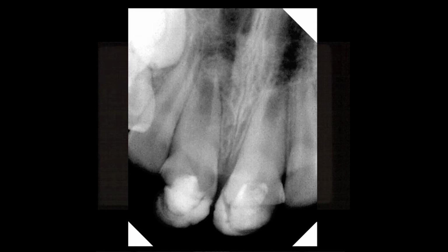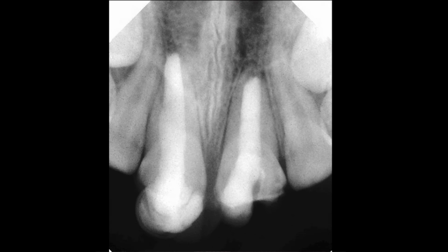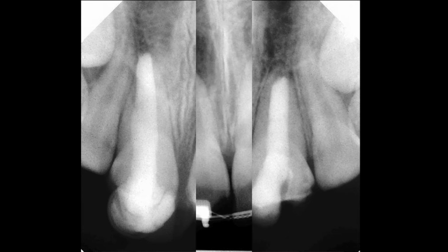Here are some examples. In this first case, we have two maxillary central incisors with necrotic pulps, open apices, and large lesions surrounding the apices. Once these teeth are cleansed in a routine endodontic manner, the apices are filled with a plug of 4 to 5 millimeters of depth of ProRoot MTA, and then the remainder of the canal is filled with a bonded composite. And here is a completed procedure on these two cases.